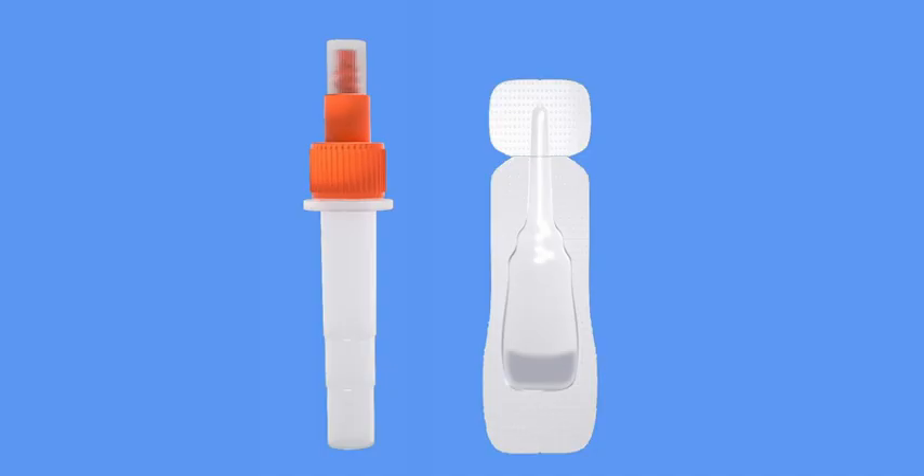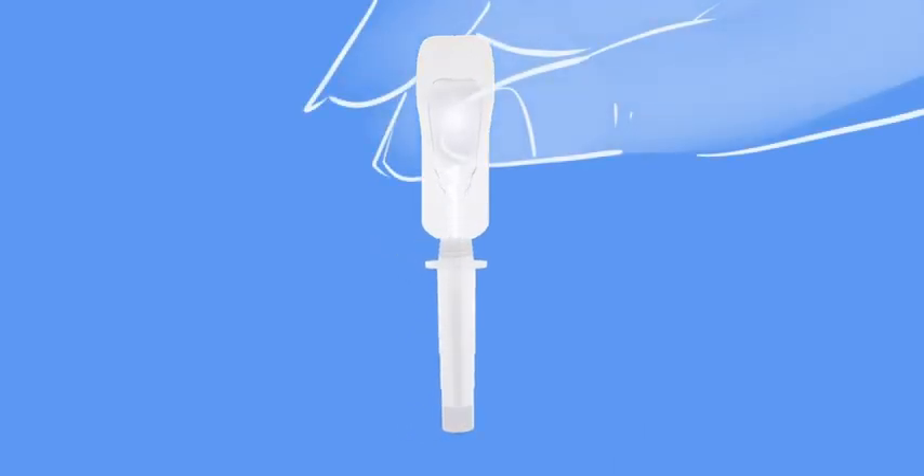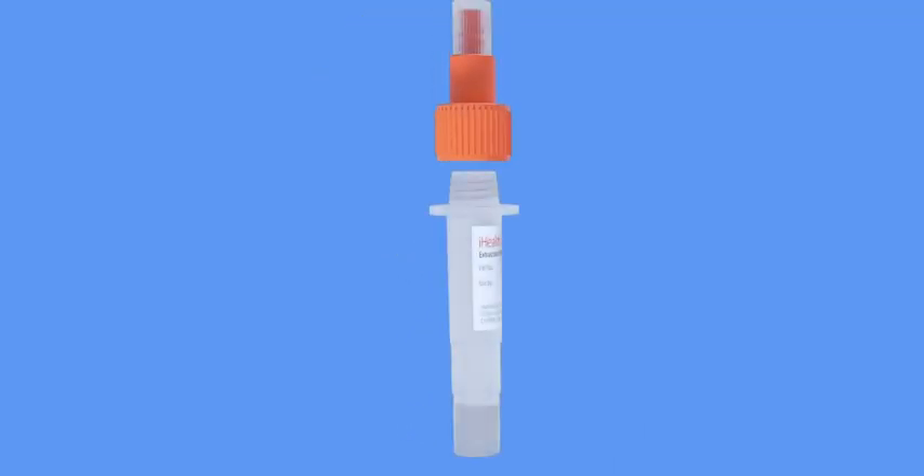If so, no problem. Remove the larger lid and then carefully tear off the top portion of your solution packet, and pour the entire contents of the packet into the tube. Careful not to spill. Now put the lid back on the tube and you're ready to go.